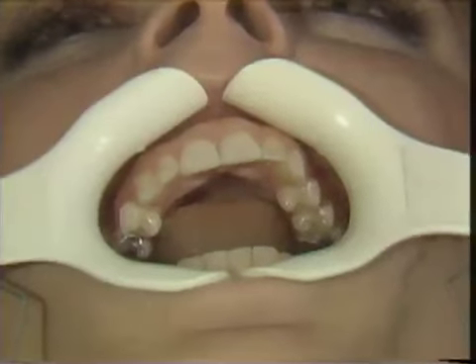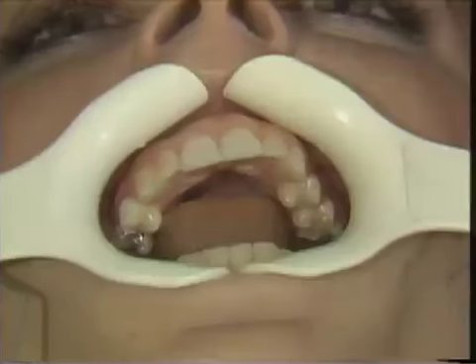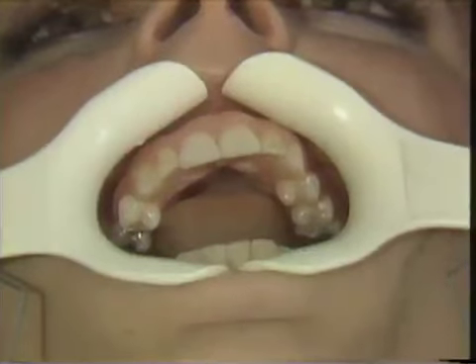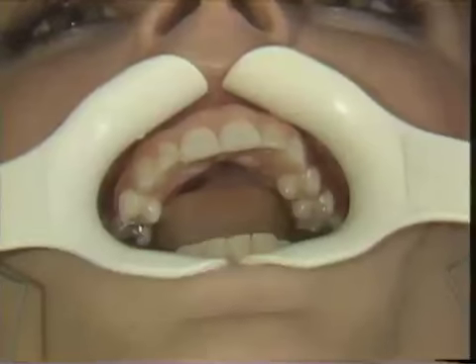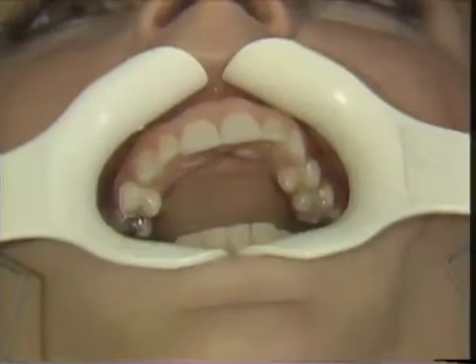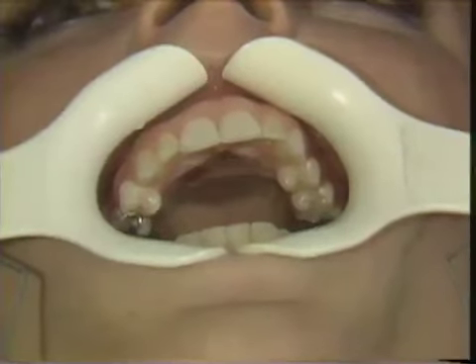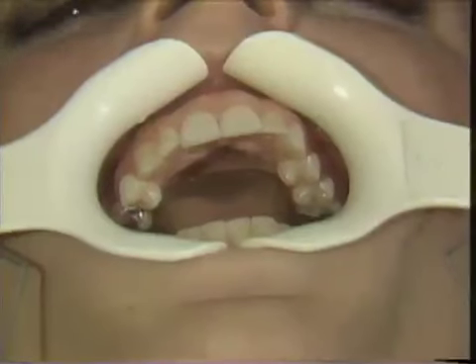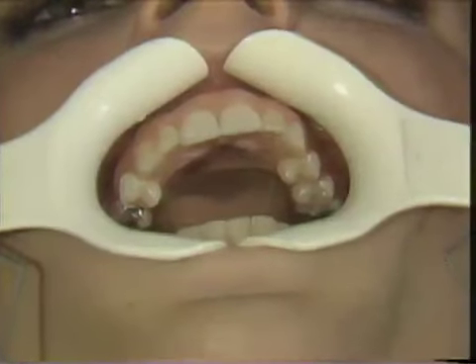Now for this demonstration, we are going to use a one-step adhesive on the upper left, central, lateral, and canine. And so I'm now going to apply the necessary catalyst, which is like a sealer, to these teeth. Paul, do you want to discuss the nature of the material I'm placing on the teeth?